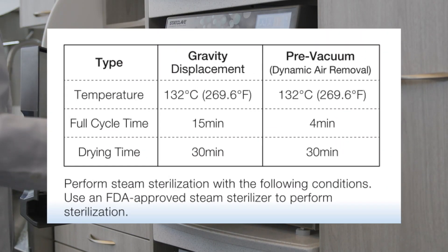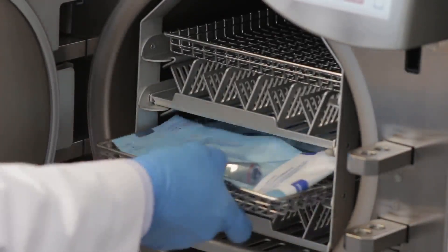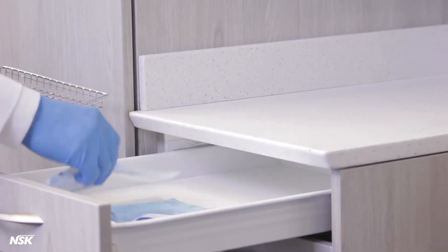Use this chart for temperature and timing. Immediately after the sterilization cycle, remove the attachment from the autoclave and store in a clean and dry location. And the process is complete.